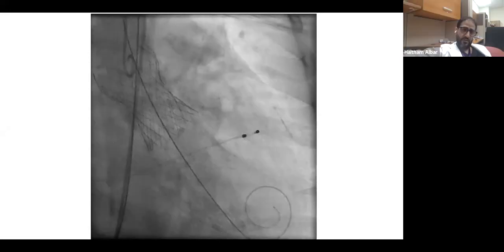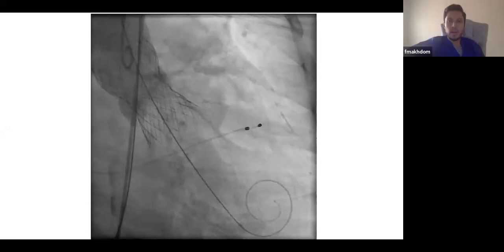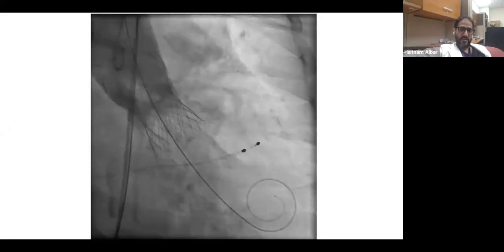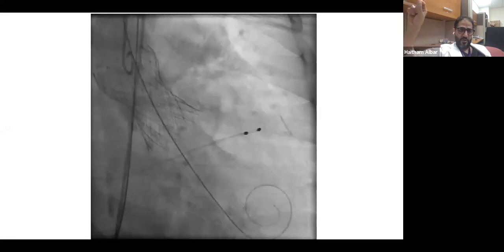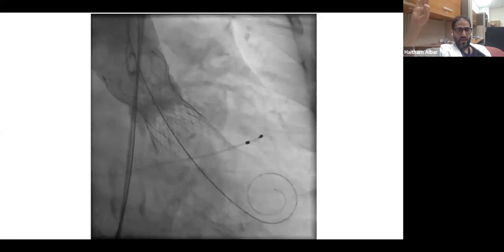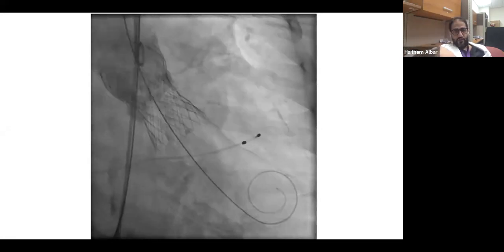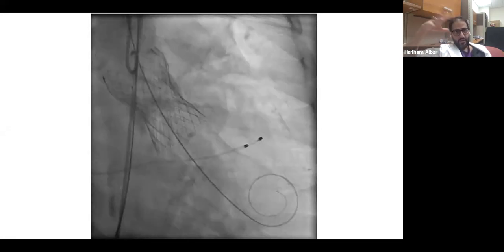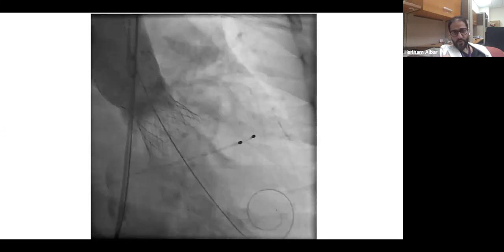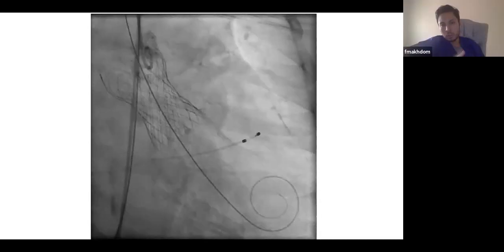It is down. I think it is down in the LVOT. Low, ventricular. Low, sorry. Low, yes. It's in the LV, more down, needs to be up. Of course there is an implanter view that I need, there is a specific view, and where is the last end of this stent where we're supposed to be. And this all must be discussed before doing the study. But from this one, clearly it's low actually. This is clearly low.